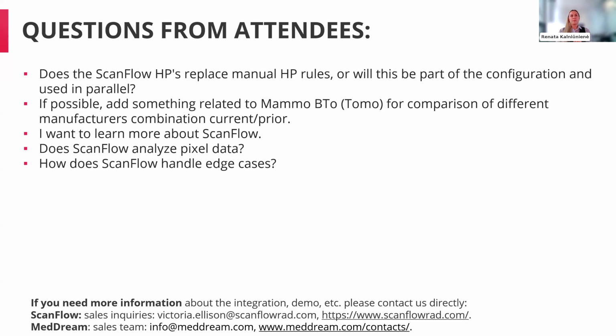So the first question: does the ScanFlow hanging protocols replace manual hanging protocols rules, or will this be part of the configuration and used in parallel? Yeah, so from our MedDream part, I will just comment quickly.